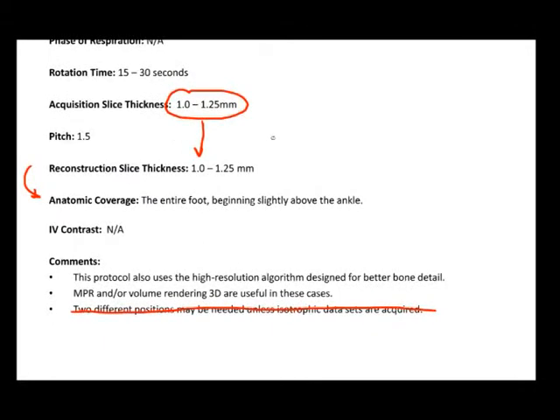But I will say that just like the hands and the wrist, you want to scan both feet so that they can be compared against the other, and the same goes for the knee as well, that you're going to scan both knees bilaterally just so that the radiologist will have something to compare one to the other with.